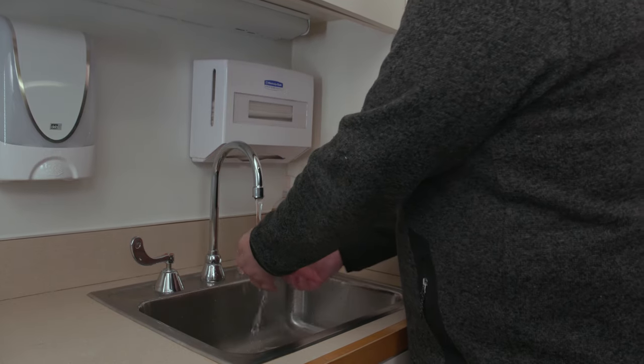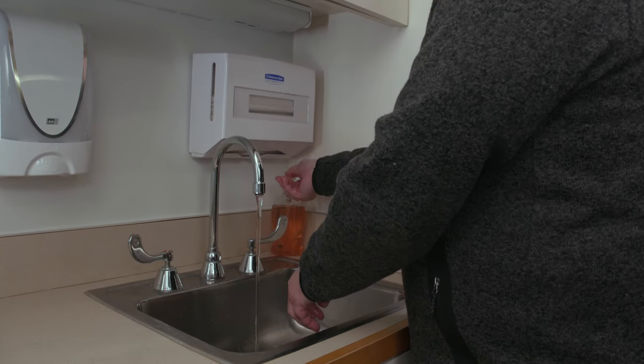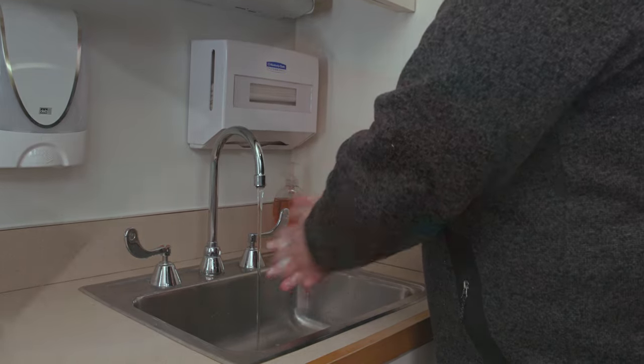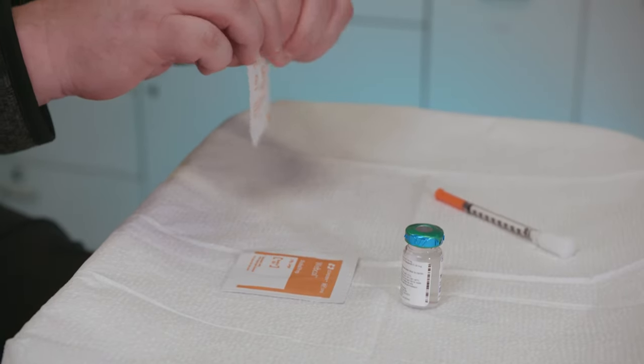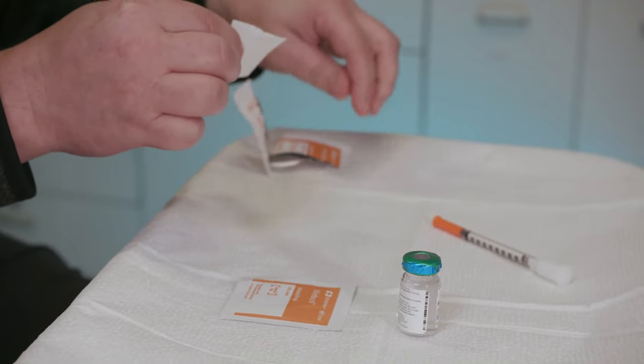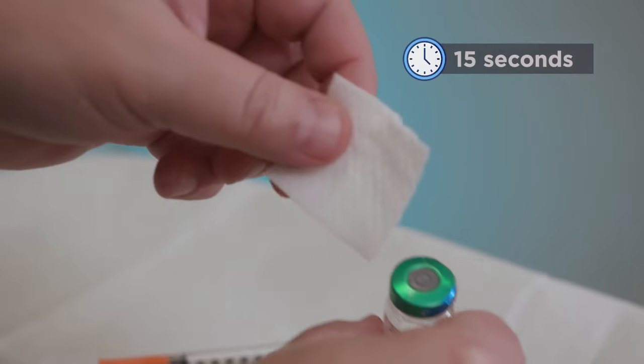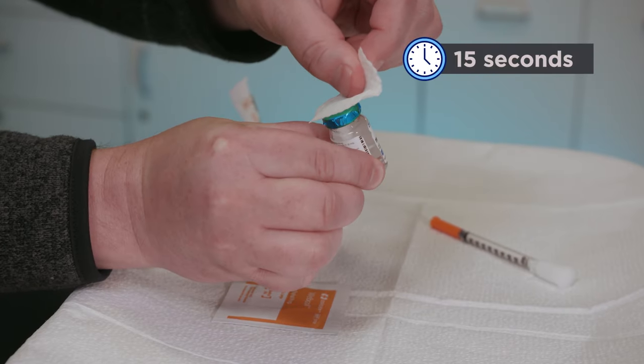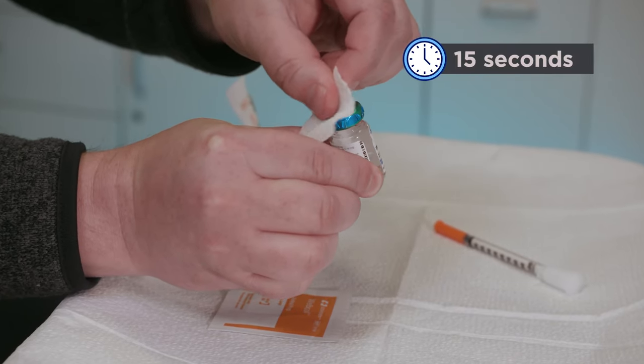Once you have your supplies, wash your hands well with soap and water. Open an alcohol wipe and scrub the rubber stopper on the top of the vial for 15 seconds. This will kill any germs on the stopper.